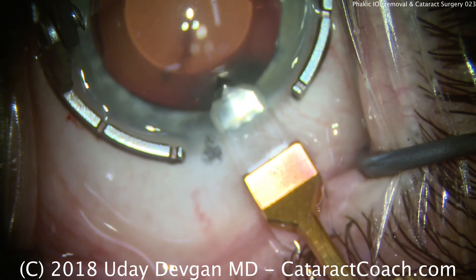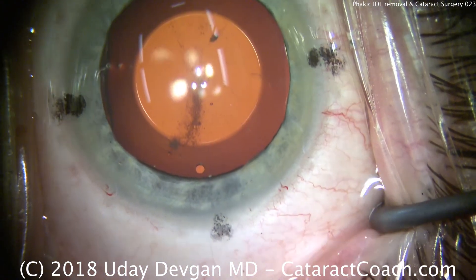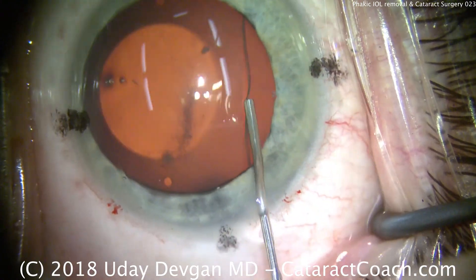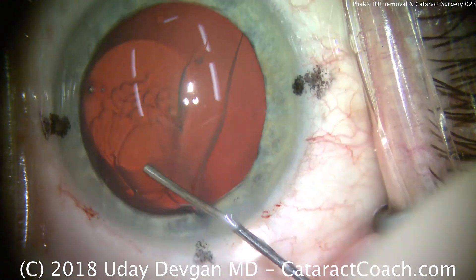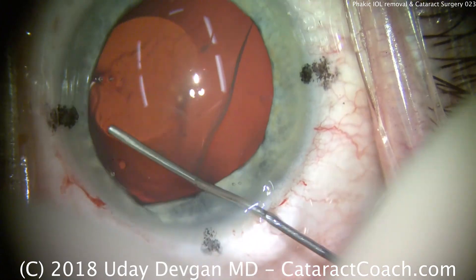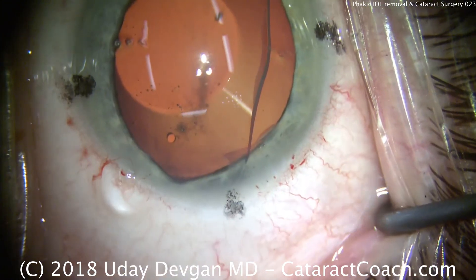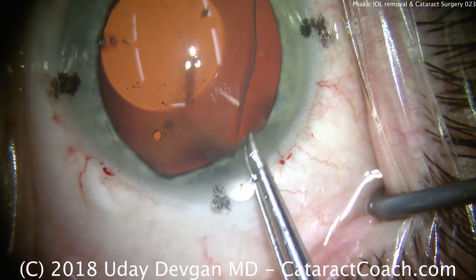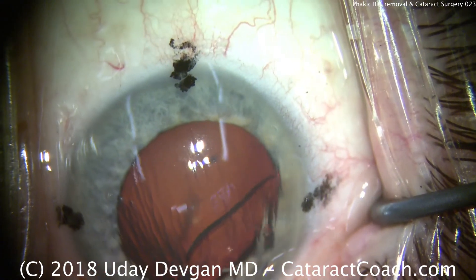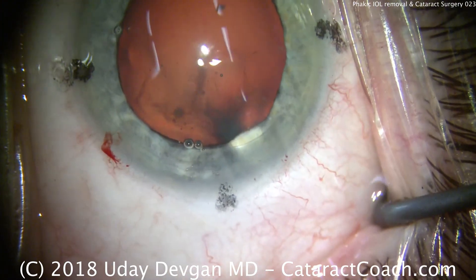There's our main incision being made. Now we're going to go inside the eye and we need to visco-dissect that phakic IOL up out of the posterior chamber. So we'll go under the lens, inject dispersive viscoelastic, and slowly tease the lens up. We'll go in through the side port and inject some more to protect the corneal endothelium. We get a good firm grasp and we can pull — this is a very flexible lens that collapses on itself — and there's the entire phakic IOL removed in just the one maneuver.